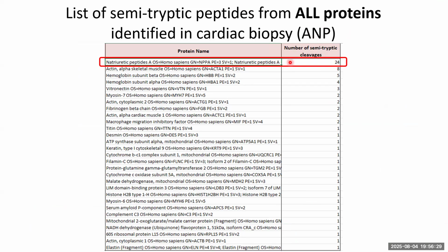So that one is on our list of proteins to look for from now on. Haven't seen any since, but that was a real good indication that this backstop that we have built into our script will help us spot things that are unexpected or novel or unusual. So we get a chance to look for things that are not the usual sort of flavor.